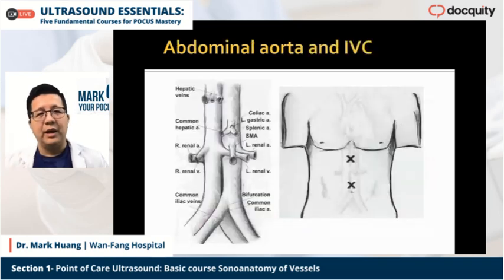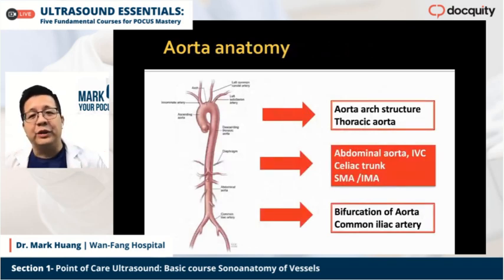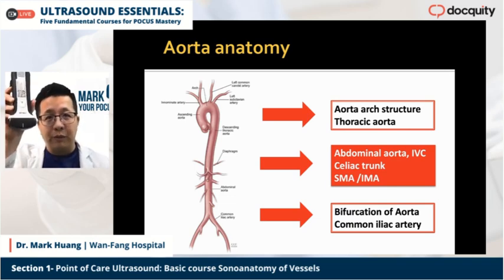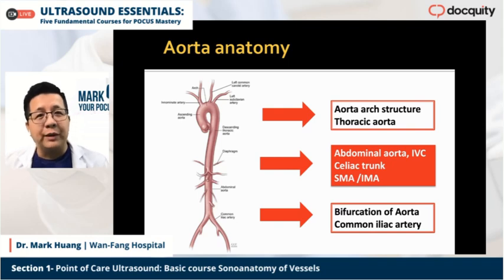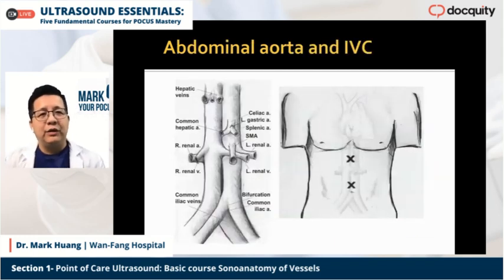Okay, so let's focus more on the abdominal aorta because it's easier for us, because we can use the abdominal probe or curved probe to explore the problems of the aorta, and it's a very important and crucial disease. Okay, so let's review the abdominal aorta and IVC.